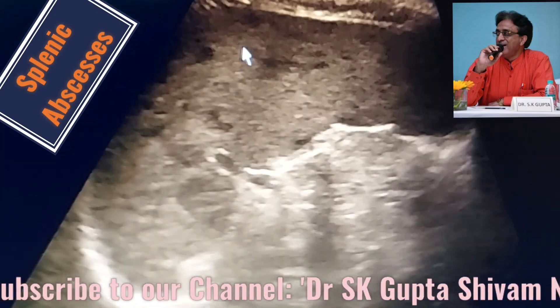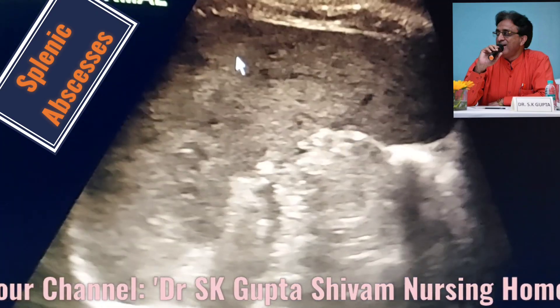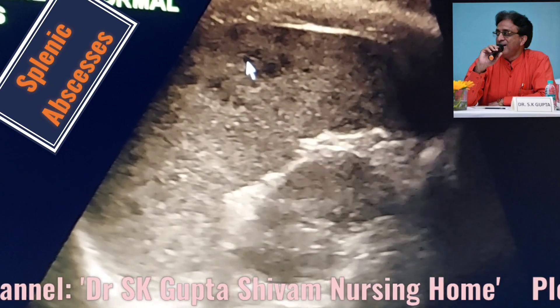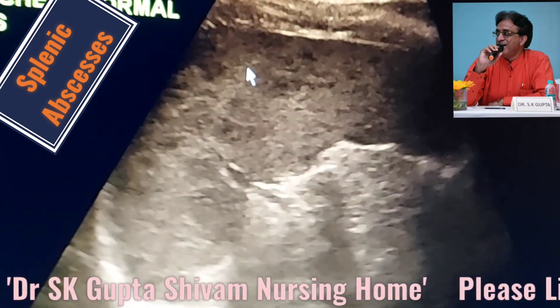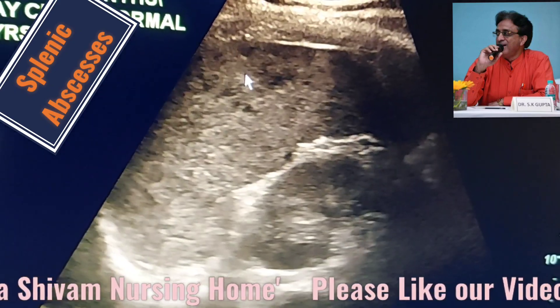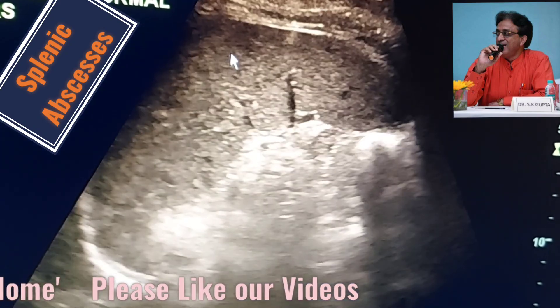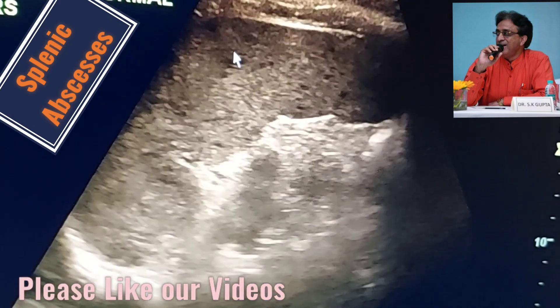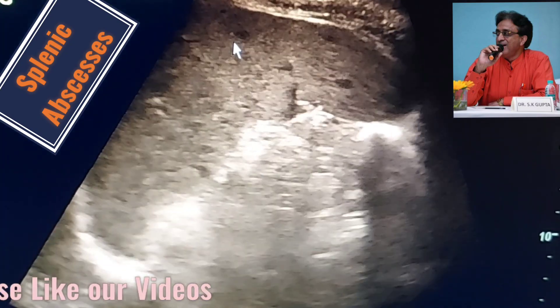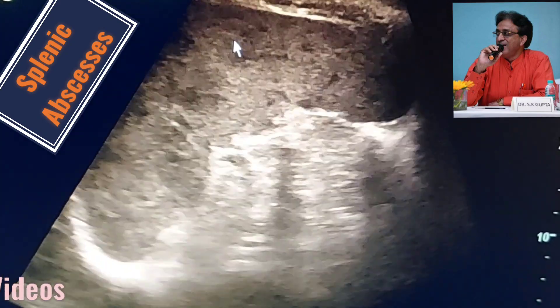These are nothing but splenic abscesses, which are probably responsible for his fever. Splenic abscesses are generally very uncommon because the spleen has a wonderful reticuloendothelial system, and so splenic abscesses do not normally form.